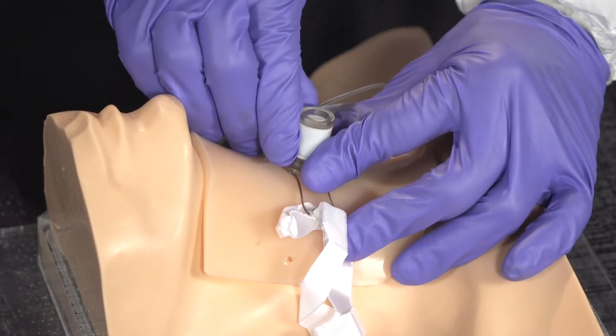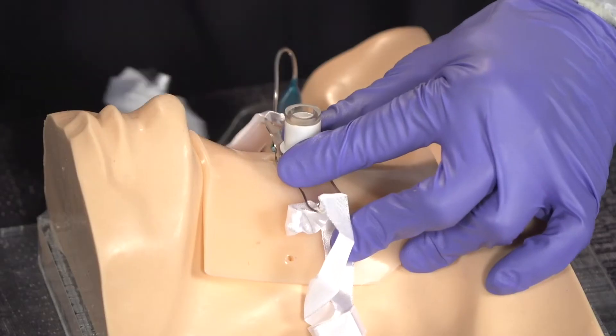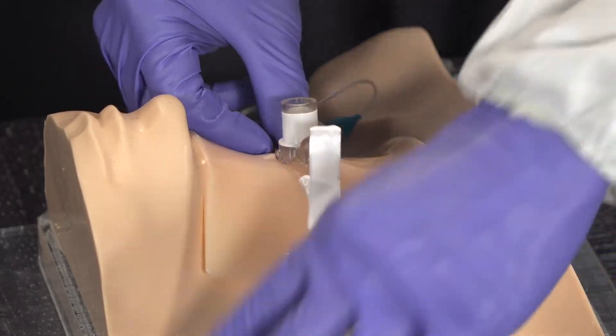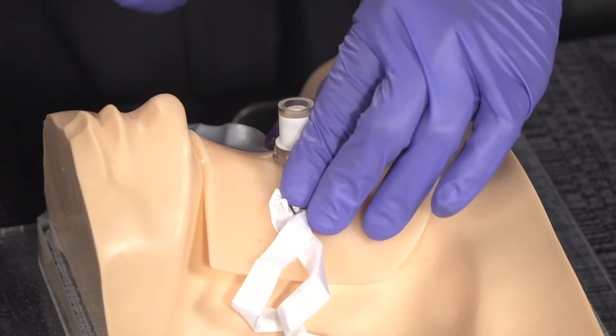Once the cric tube placement is confirmed in the trachea, secure it with the bands that come with the kit. Run them around the neck, being careful not to tie too tightly so as not to cut off circulation, then ventilate the patient per protocol. Following the DSI sequence, this patient will require post-airway-management sedation — be mindful not to leave that out.